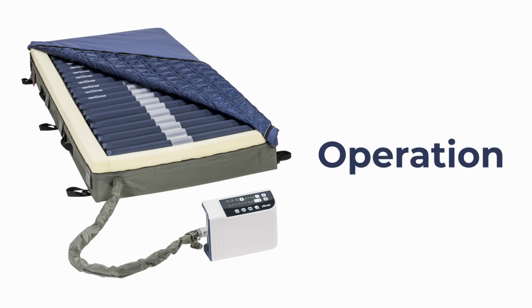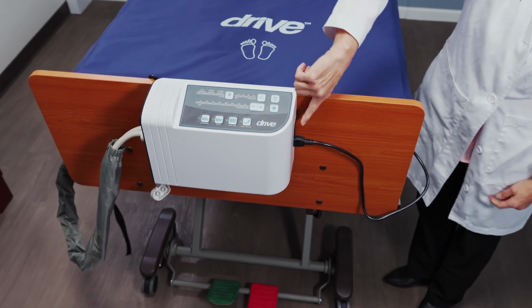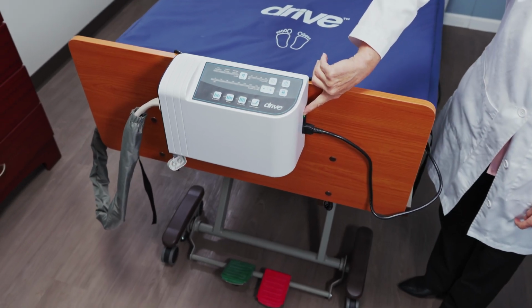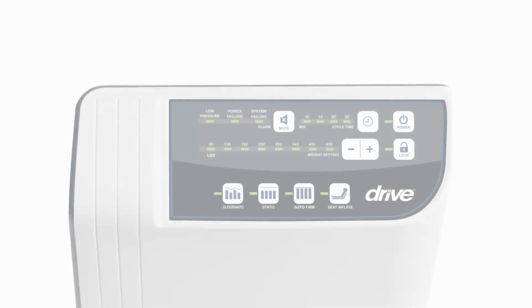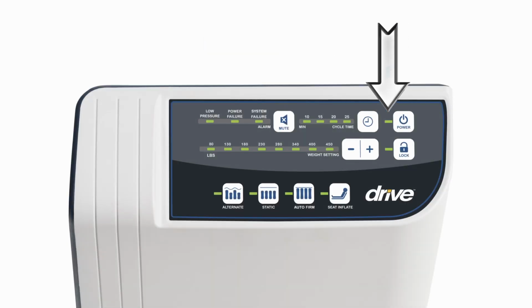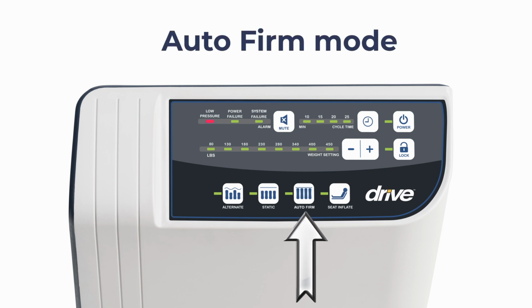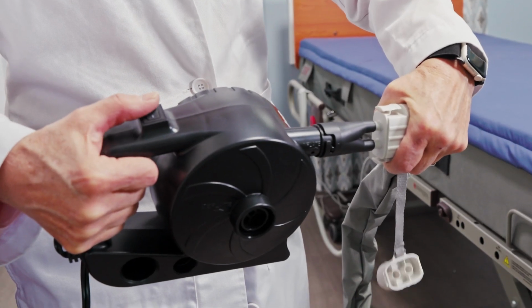Okay, we're now ready to review how to operate the easy and intuitive, innovative, feature-rich dual therapy PreserveTech MedAire Edge. First, switch on the main power button found on the right side of the control unit while facing the bed. The PreserveTech MedAire Edge will beep once, the power switch will light up green, the low pressure light indicator will flicker red, and the system will automatically go into auto firm mode for about 40 minutes to fully and automatically inflate. Quick fill pump will fully inflate the mattress in 2 minutes.